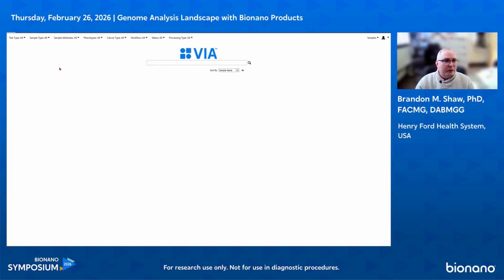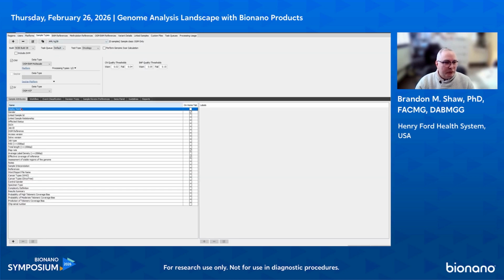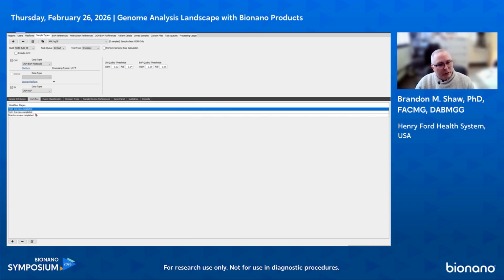So some of the features that I would like to point out very quickly: as an admin, you do have the ability to go in and structure things so you can add sample attributes that you want to show up in your home screen in this tab. You can do a workflow. So right now our workflow is set up for a Tech 1 and a Tech 2 review and then director review completed. You can make this as complicated or as simple as you'd like, depending on what you want.